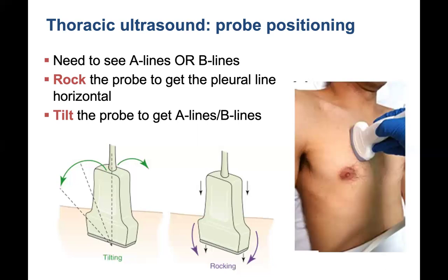Remember, I think of those two lungs kind of like two 2-liter Coke bottles. So when you move to the lateral or the anteromedial, this blue point, the lower blue point here, you might need to tilt more such that you are perpendicular to that visceral and parietal pleura. So it might be a more extensive tilting to get those A lines or B lines to come out.